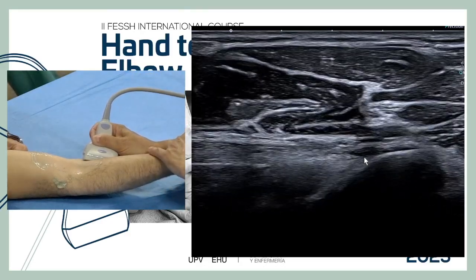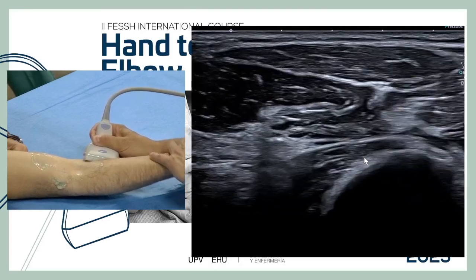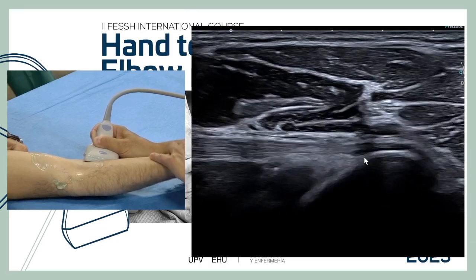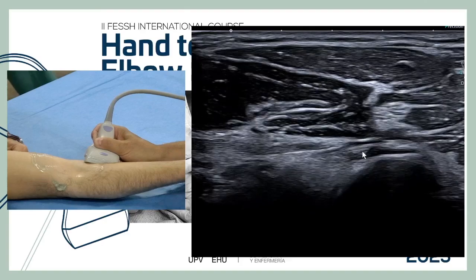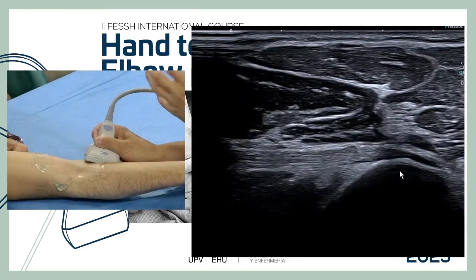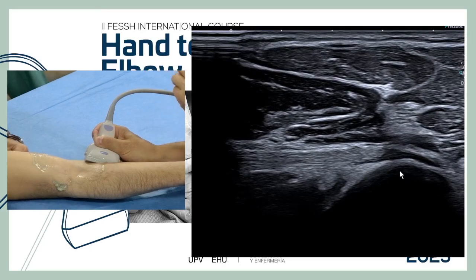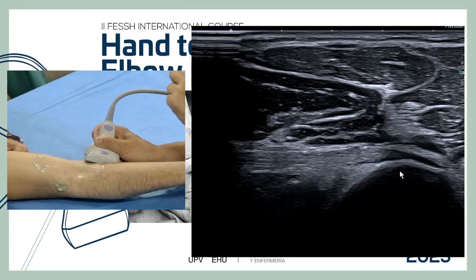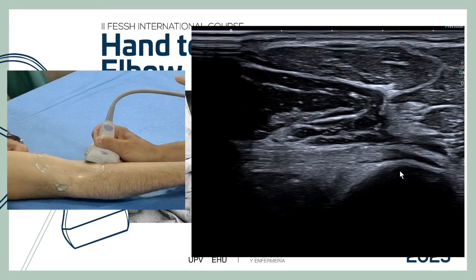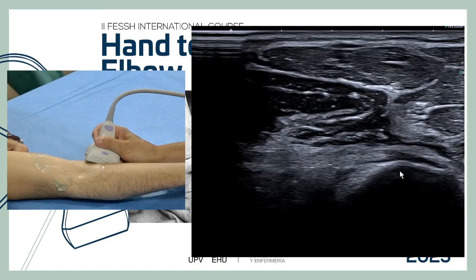It is really important, when evaluating for ruptures, to pronate and supinate dynamically, trying to see the insertion at the tuberosity. These fine maneuvers let us see how the tendon moves with pronation and supination. This dynamic exploration is very important: in a complete rupture, you will see no connection between the tendon and the bone. This is the most important and easiest way to confirm a tendon tear.